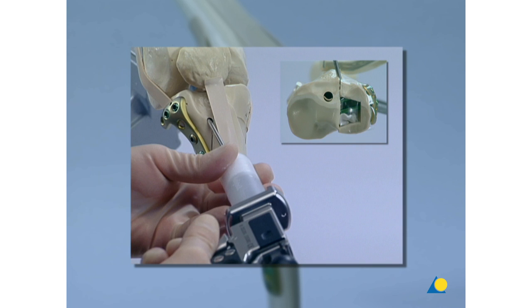The use of the LCP plate placed laterally in buttress mode, and the use of a bone substitute, Kronos inject, filling the subchondral defect created after anatomical reduction of the surface of the lateral tibial plateau.